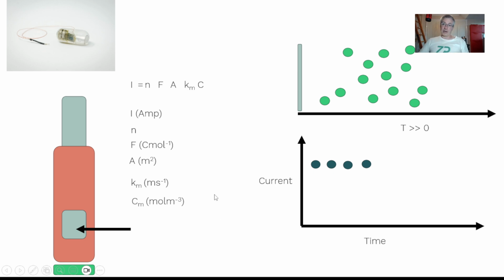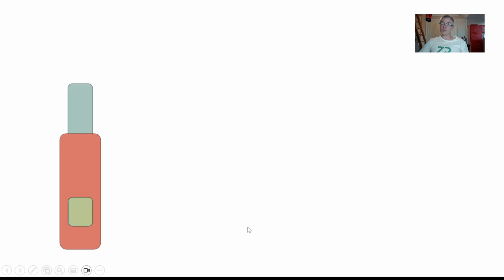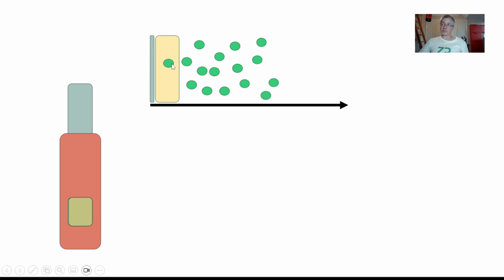Right, I'm now going to start layering on the layers that turn this bare electrode into a CGM, a continuous glucose monitor. So the first thing we're going to put on there, I've done this in a slightly wrong order, but it's actually a membrane. So I want you to imagine our electrode surface, and we've got distance from electrode, but I've put a membrane over there. Now I'm going to put my electrochemically active molecules into a solution. You must understand now that not all the electrochemically active molecules get to the surface. In fact, only a few of them get to the surface, because only a few of them actually end up getting into the membrane. So at t equals 0, nothing's happening.